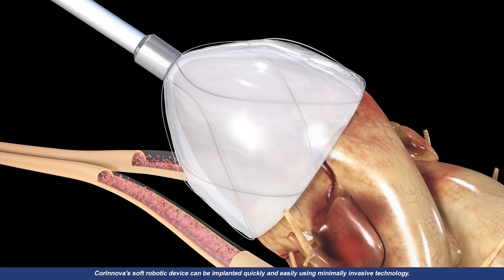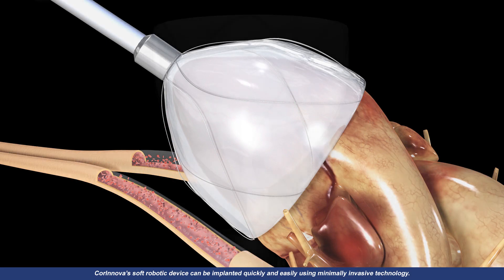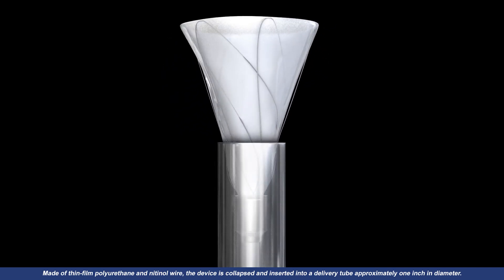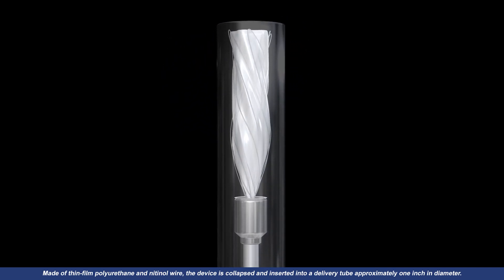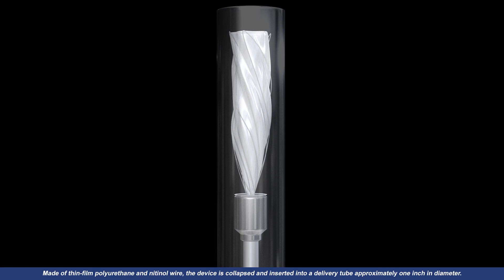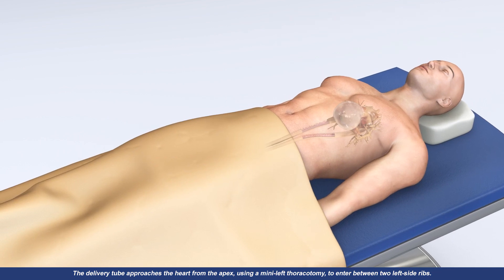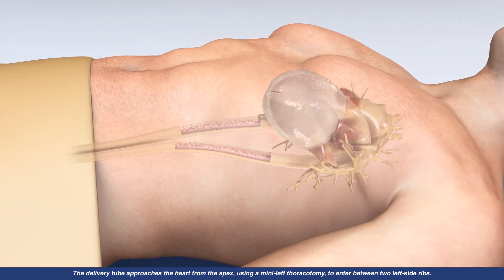Coronova's soft robotic device can be implanted quickly and easily using minimally invasive technology. Made of thin film polyurethane and nitinol wire, the device is collapsed and inserted into a delivery tube approximately one inch in diameter. The delivery tube approaches the heart from the apex using a mini-left thoracotomy to enter between two left-side ribs.